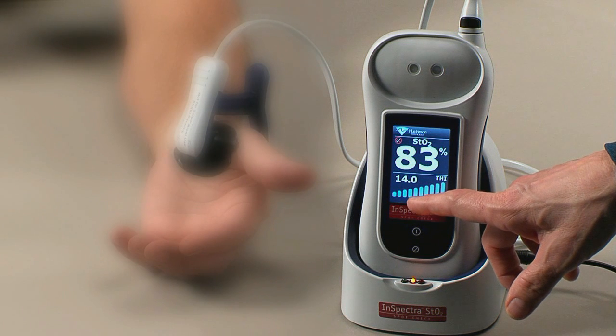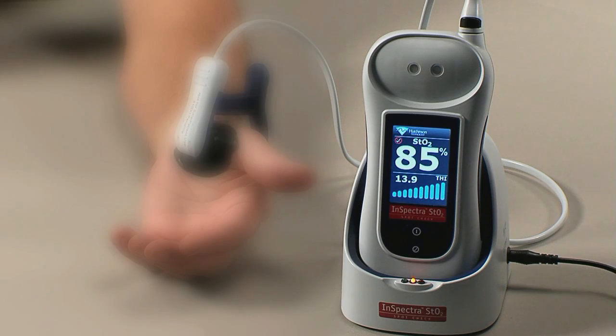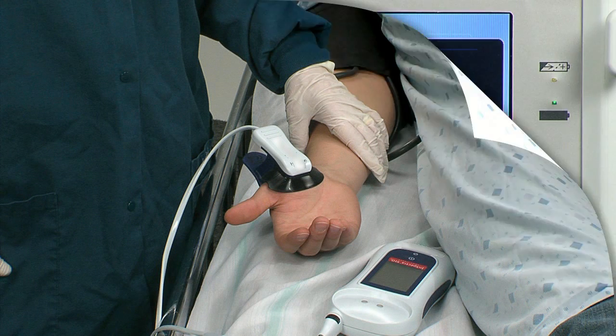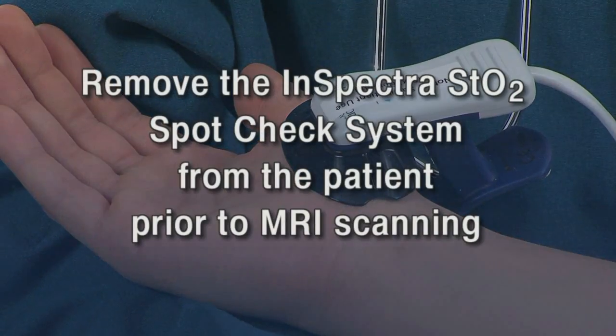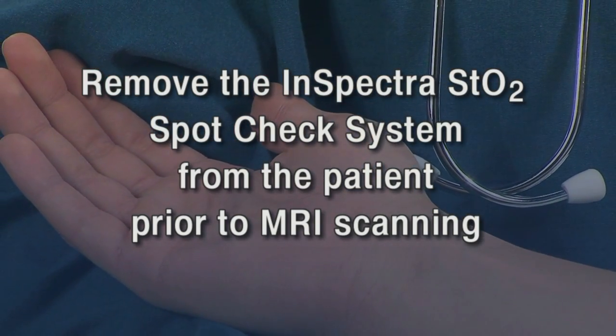Check THI signal strength on the device screen. A THI greater than 5.0 indicates sufficient hemoglobin to obtain an adequate signal in most circumstances. Do not leave the InSpectra STO2 clip on the patient's thenar site for longer than 15 minutes. If continuous monitoring is desired, use the InSpectra STO2 tissue oxygenation monitor, model 650, and the InSpectra STO2 sensor, model 1615, for trended patient STO2 measurements.